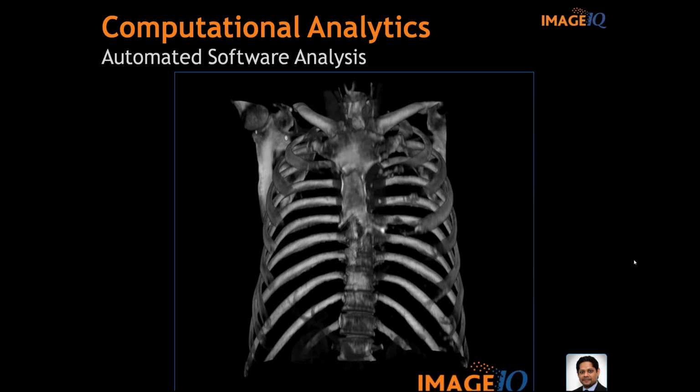Yeah, and that's a good point that you bring up. You can choose how you want to use automated software. You don't necessarily have to say, I'm going to put it on my PACS system and let it run over all these scans. You can have the software as a CAD, computer-assisted diagnosis, where the radiologist looks at the outputs of the image and makes their own assessments and says, yeah, I agree or I disagree, and has an input, right? Not necessarily let it drive on its own, right?